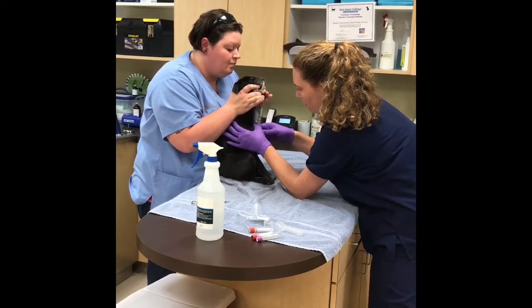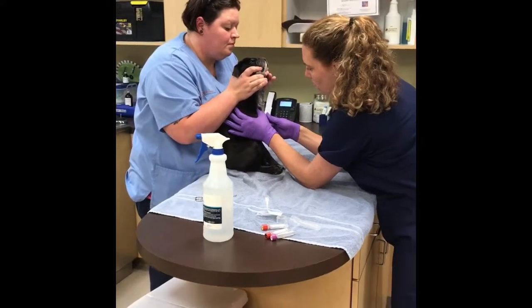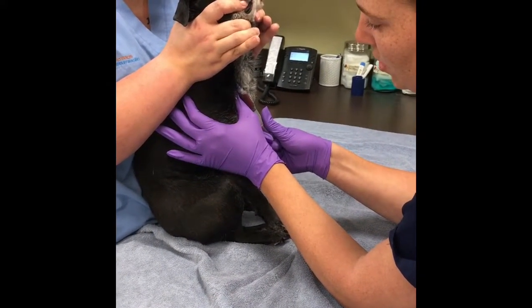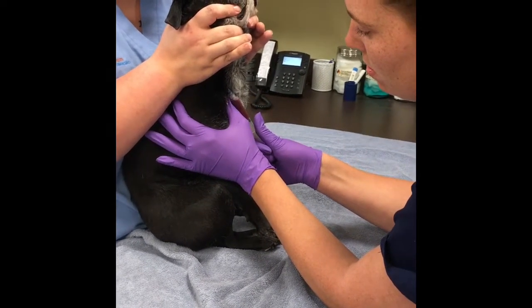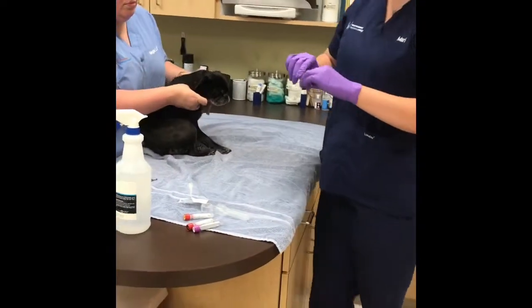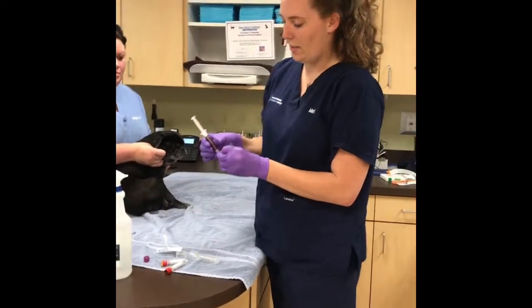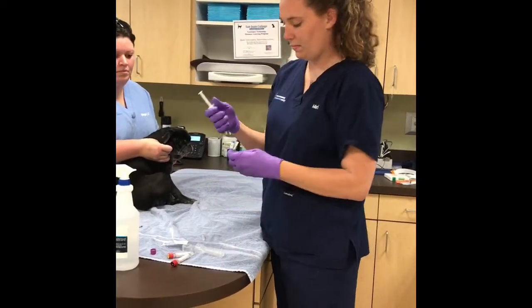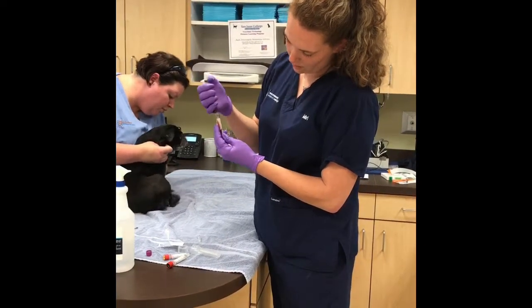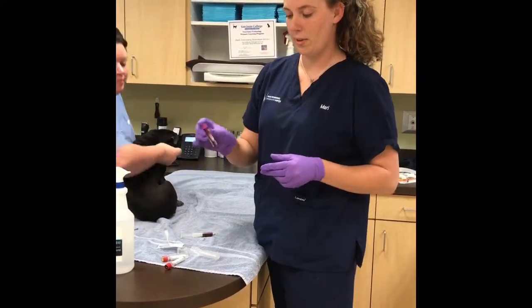Insert with my bevel up, and draw back slowly to try to prevent any slicing or damage to the red blood cells. Okay, I'll place my finger at the insertion site, ask my assistant to hold off. I'm going to place my blood first in my lavender top with my anticoagulant additive. Okay, I'm going to fill that up to the black marker on the tube. I'll invert that 3 to 4 times.